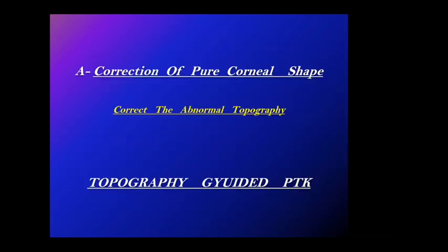Now we are going to business. So all this was introduction. Correction of pure corneal shape. So we divide it into corneal shape, corneal function, and mixed. This is where the art comes in. Only shape, corneal topography. Topography guided PTK. It's not wavefront.